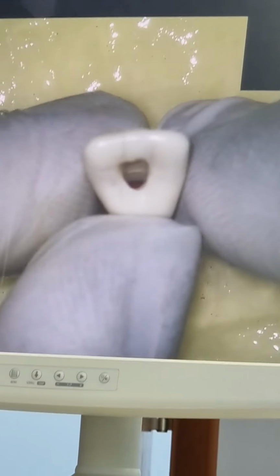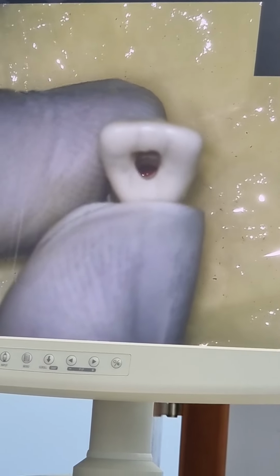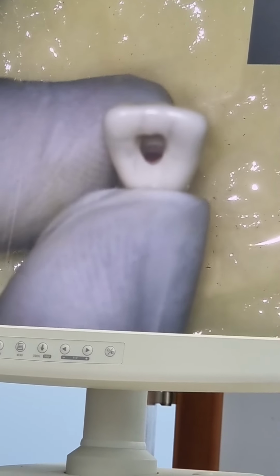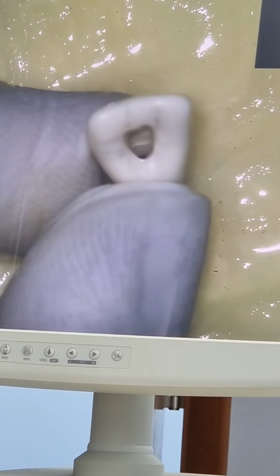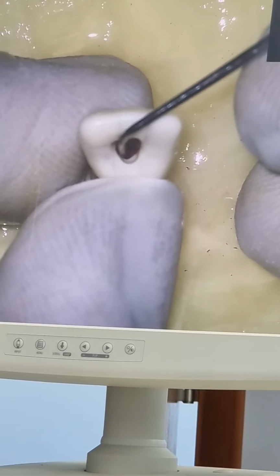inspect all the walls. See, everything is smooth. The walls should be smooth, with no irregular or rough margins. Check for any irregularities with your explorer. You can see now the explorer.